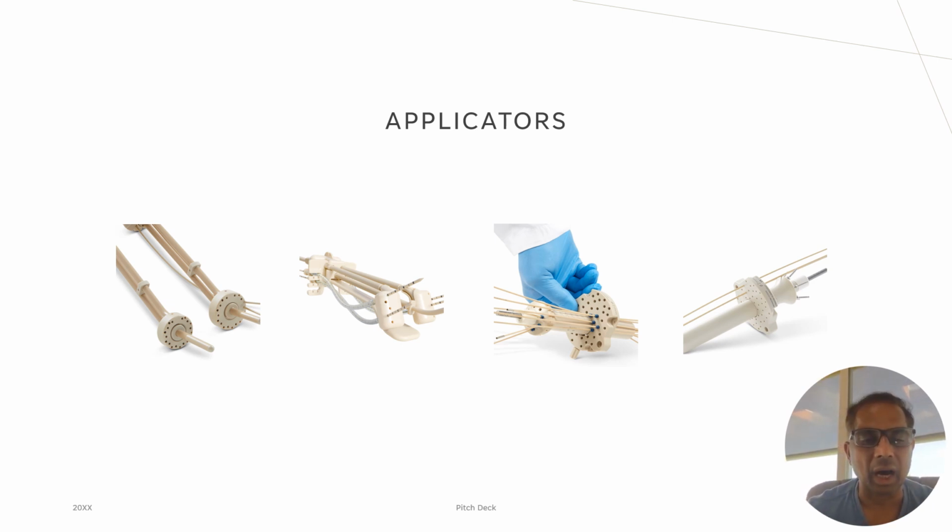These are the hybrid applicators I'm going to cover. The first one is an Aarhus applicator. It has a tandem and a ring, but there is no ring channel. It has straight and oblique needles to cover both medial and lateral parametrial disease. The second applicator is the tandem ovoid, which has both straight and oblique needles with a guide tube to help placement of the needles.